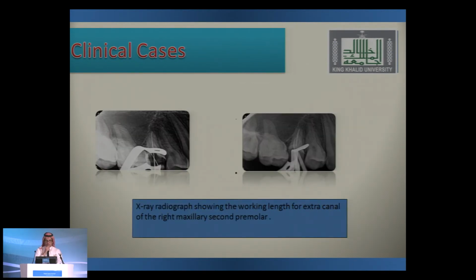When I opened it, you could see it with two files, palatal and two buccal. When I showed this X-ray figure on my computer, I asked, what is that? It's not normal. So I went to another clinic and opened Google. I wrote, upper second premolar with three canals. I found a lot of pictures like that. It was the first time I had heard about that.